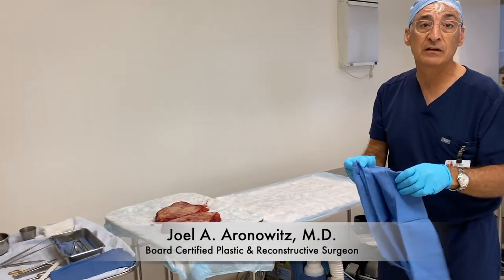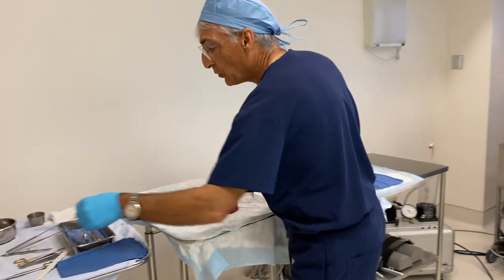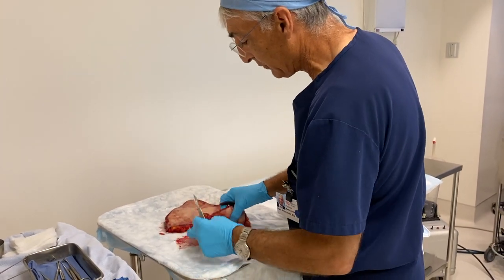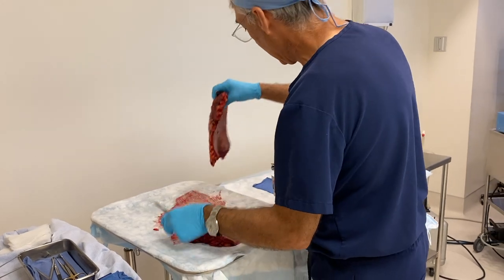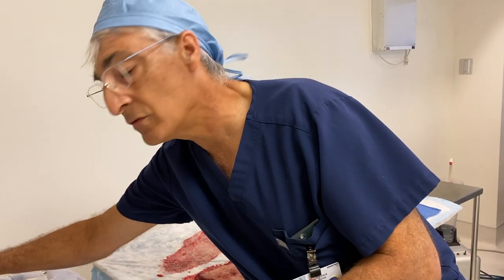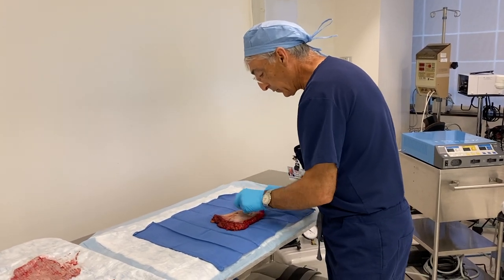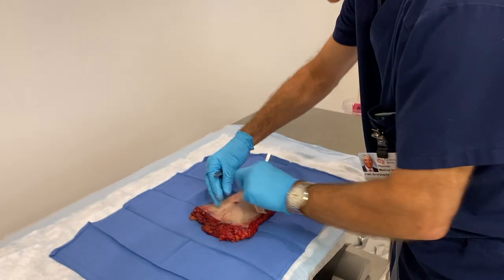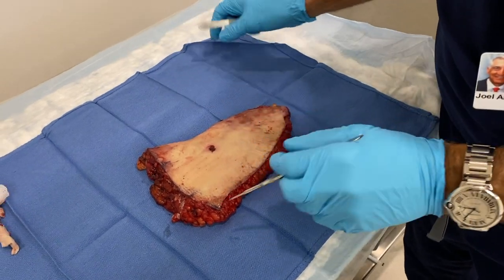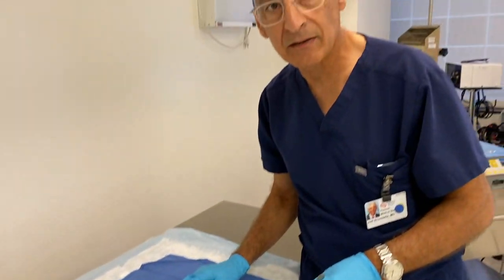I want to show you a little trick for aspiring surgeons in training. After surgery, if you have access to excess tissue — this is tissue left over from an abdominoplasty — what we can do is create our own little surgical field and do a little surgery for practice before it really counts on a specimen. We're going to do a little pretend surgery for practice of suturing.